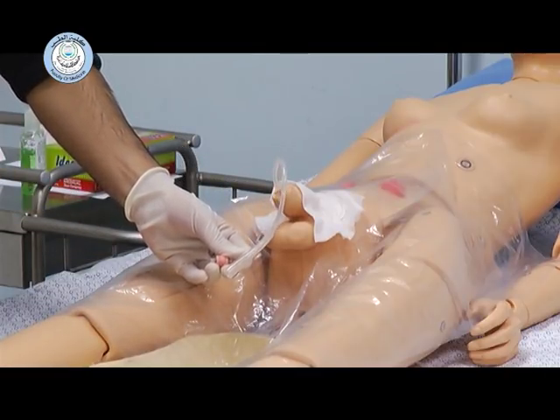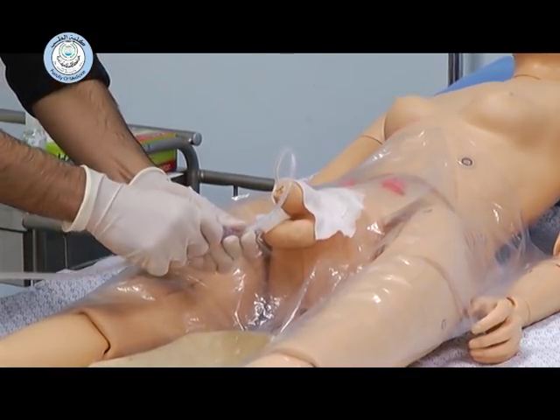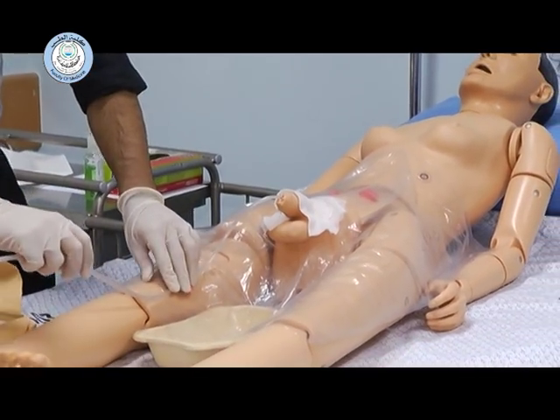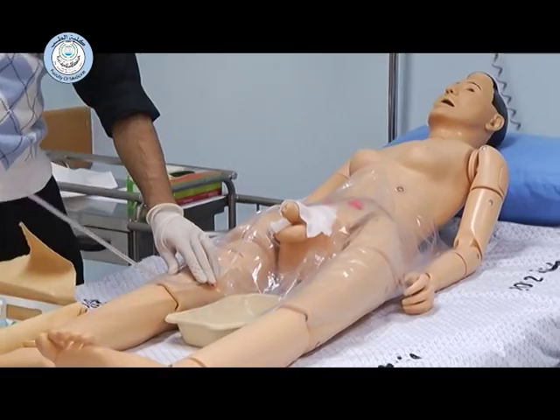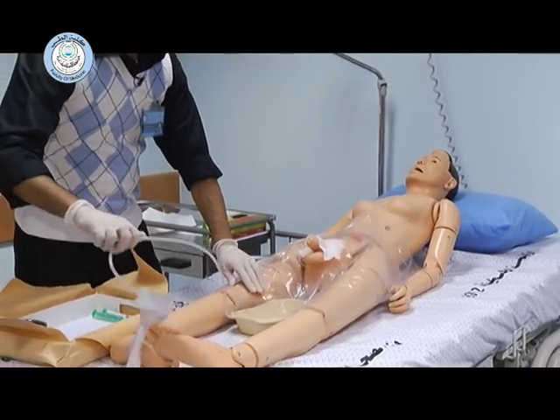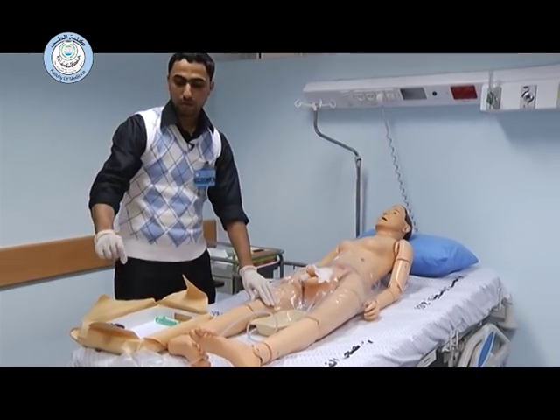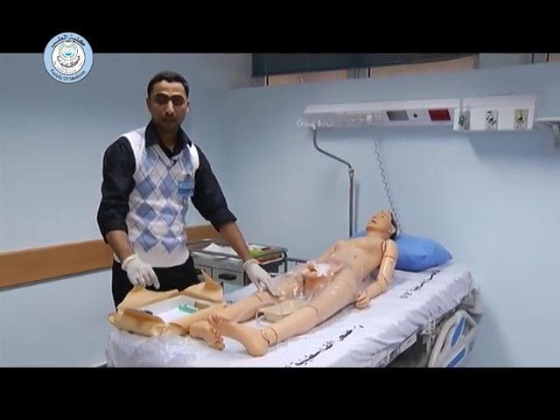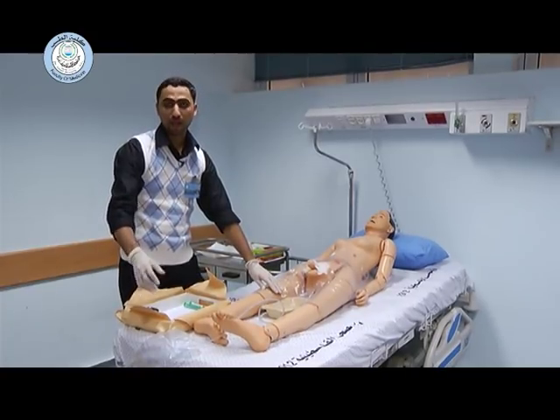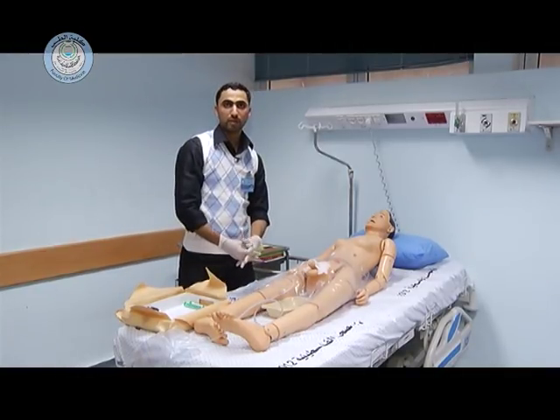Then after, you can connect the urine bag and fix it with adhesive tape to the side of the thigh. Write your name, signature, date and time, the initial amount of urine collected, and the color of the urine. Then cover the patient, and that's it — you are done.